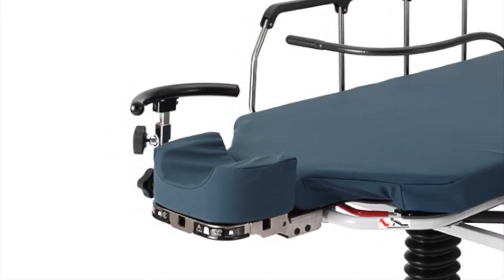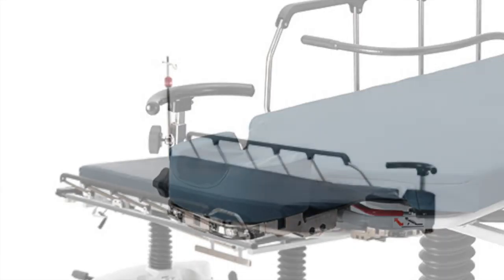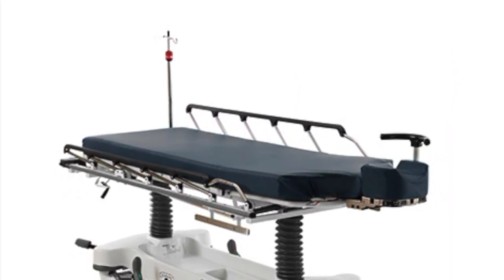The Stryker Eye Stretcher is integrated with dual pedestal hydraulics, fold down side rails, and central locking brakes.